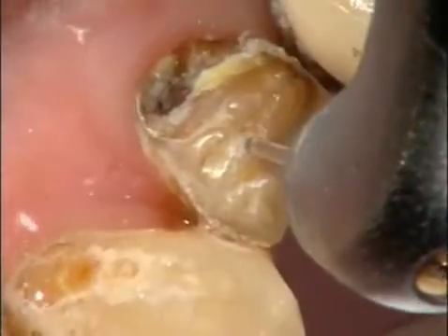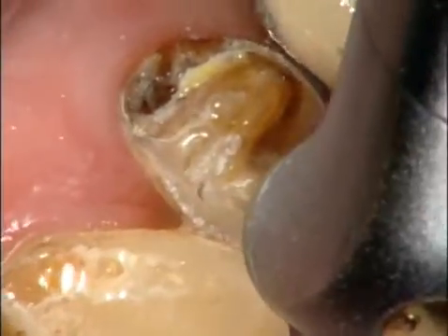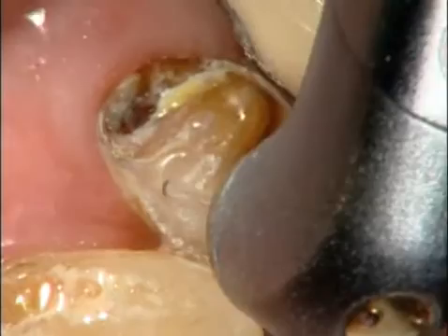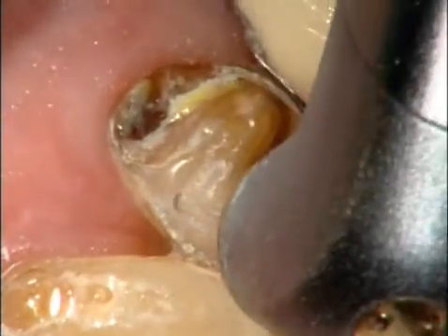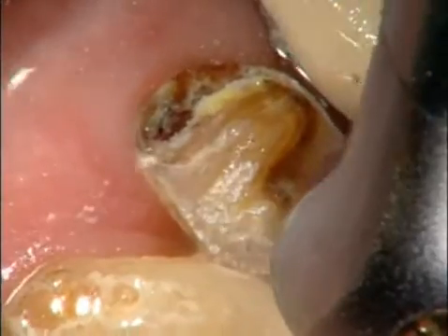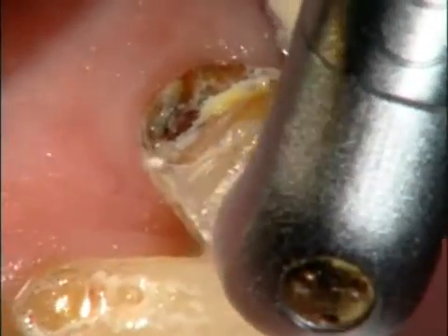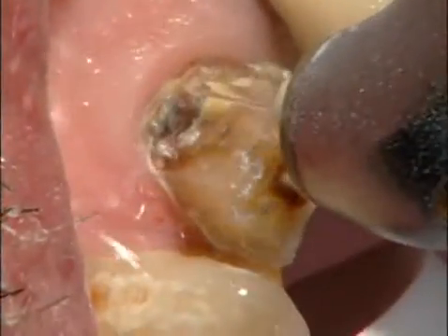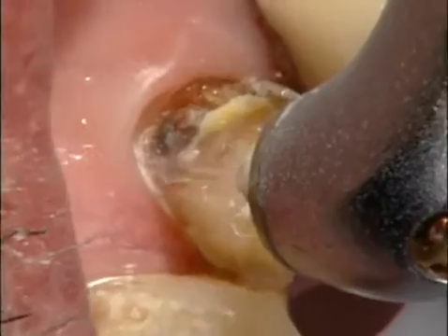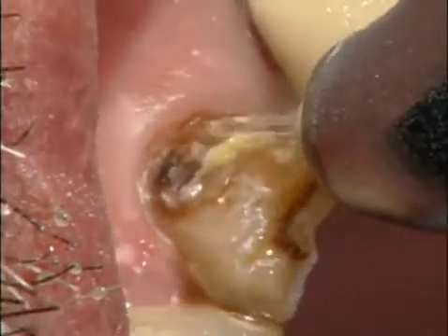So crown preps can be a little frustrating when you first pick up your laser because you're not used to spending time doing crown preps with a laser. My best advice is to do a few crown preps on extracted teeth. Learn to get the angles so that when you get to the dentin enamel junction, you've figured out how to rapidly remove that buccal and lingual enamel and place your chamfer margins.